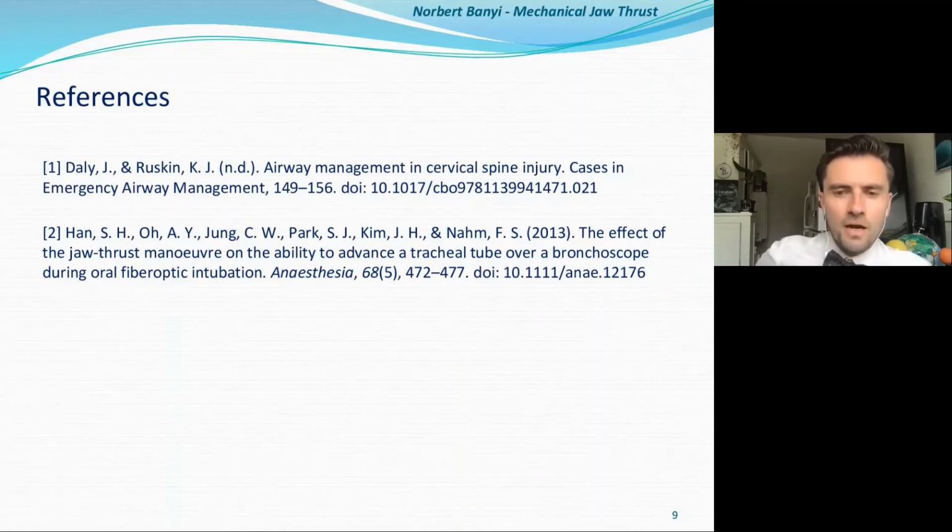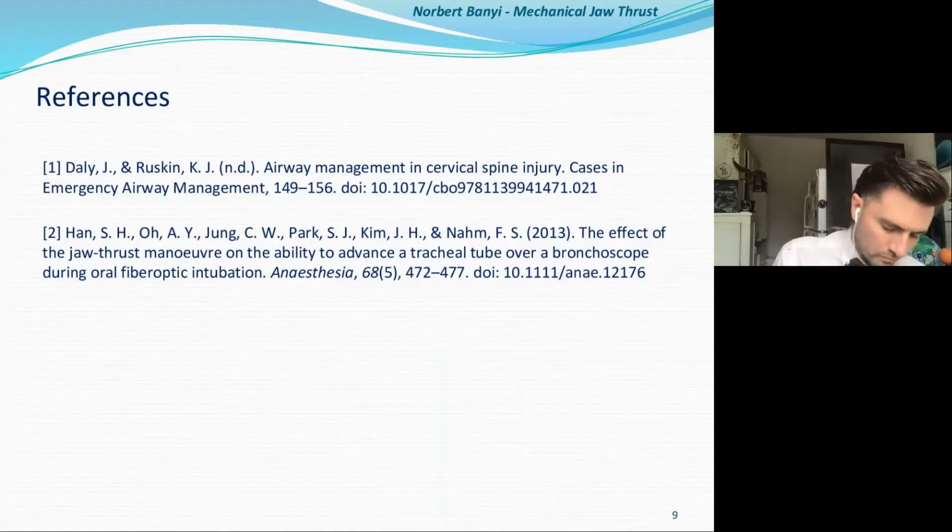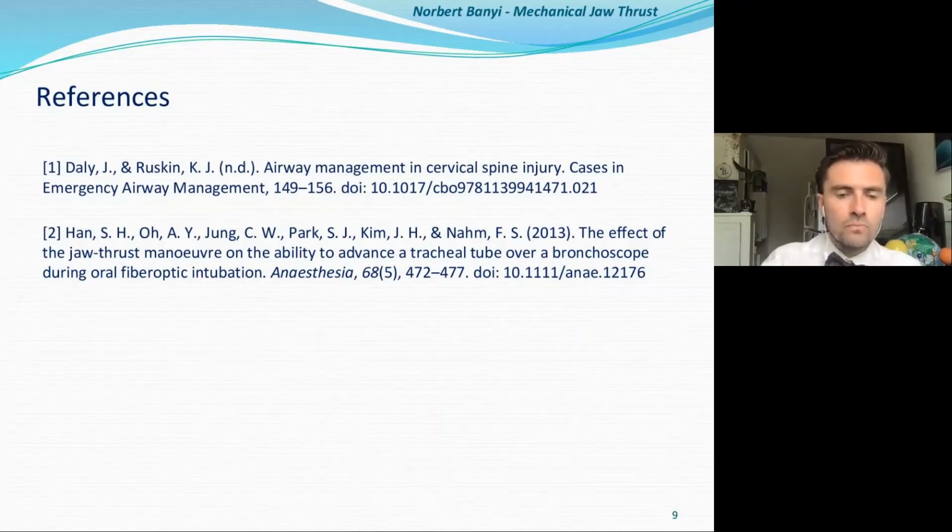Awesome, thanks. Wendy Hurlbert says, great idea. Infection control is very important in surgeries. How will you manage this? Yeah, so this device is actually a non-invasive device, so it won't be in the patient at all. There's three main challenges that can arise during bronchoscopies, which include blood leakage or cuts induced by the bronchoscopy, or airway perforation, as well as aspiration of food or anything that's being spit up by the patient during the surgery.